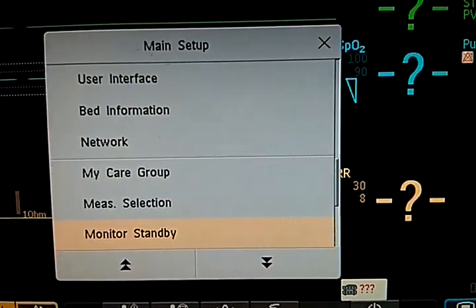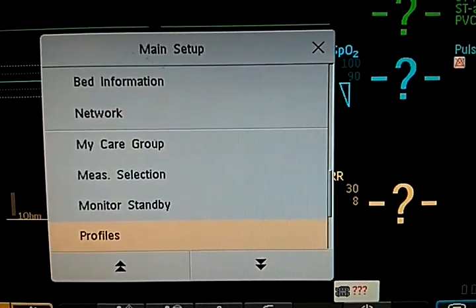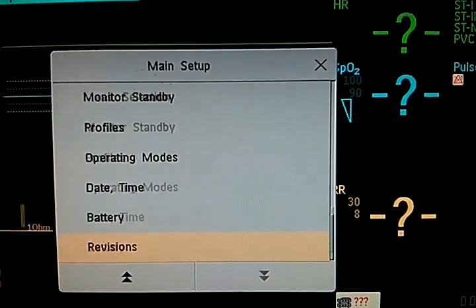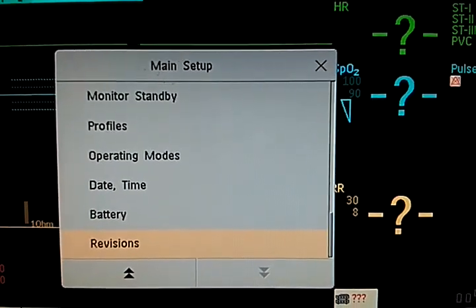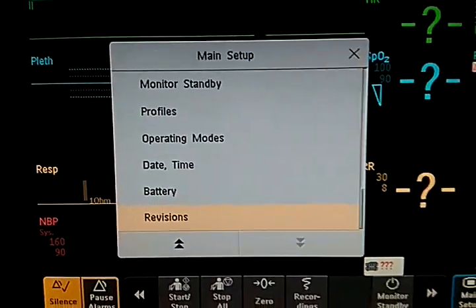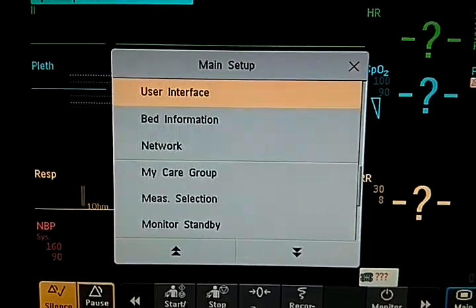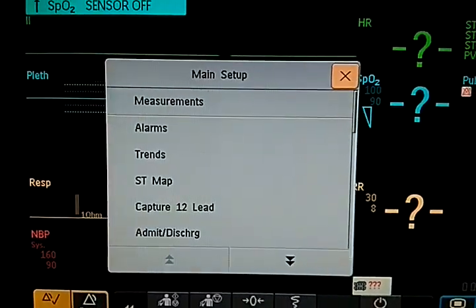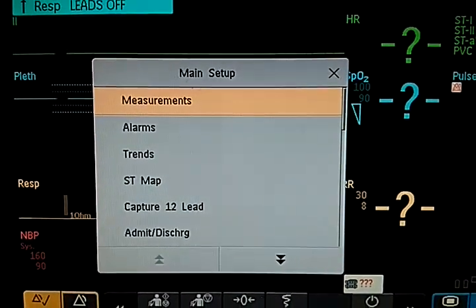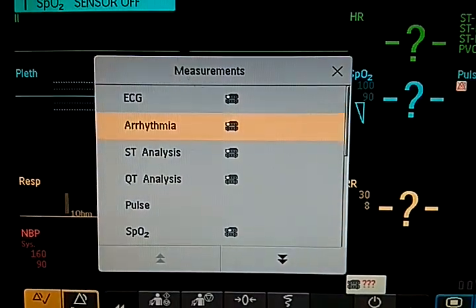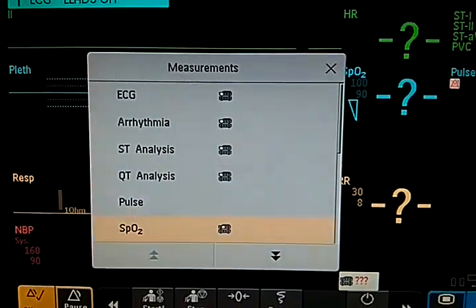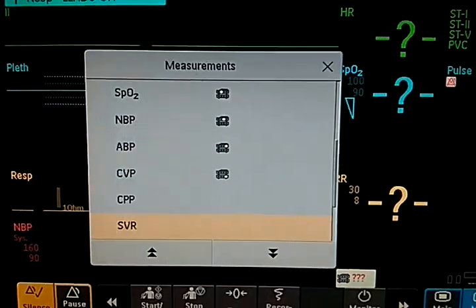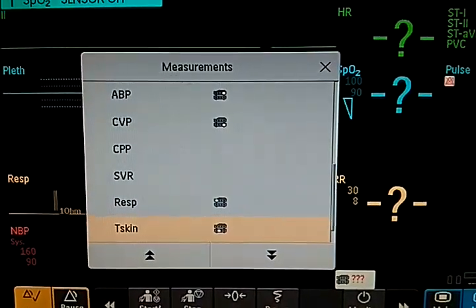So in measurements, what it can measure: it's ECG, arrhythmia, ST analysis, QT analysis, pulse, SpO2, NBP, ABP, CVP, CPP, SVR, respiration, temperature, skin temperature.